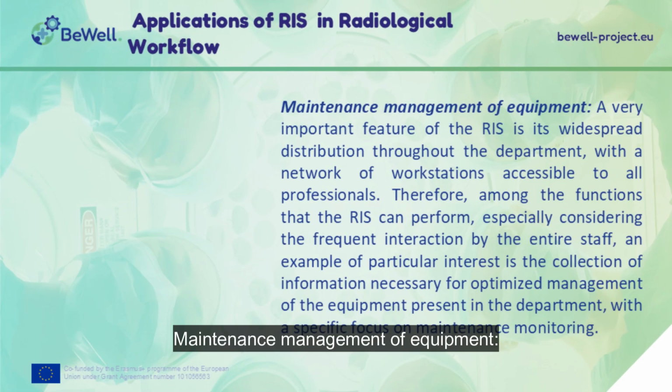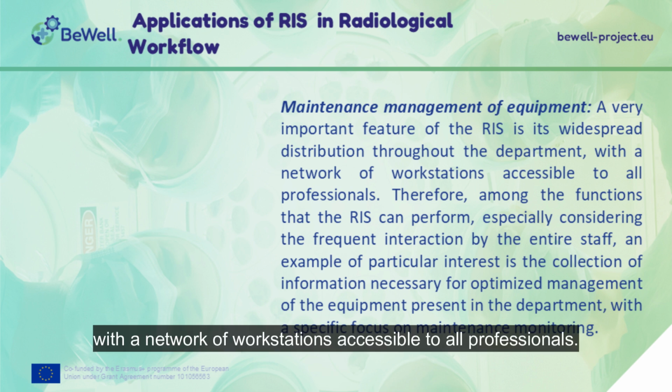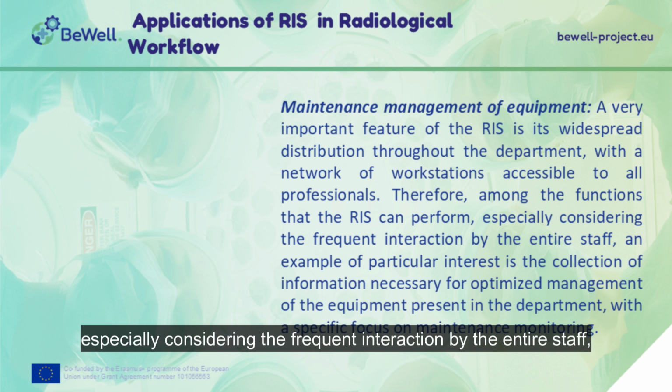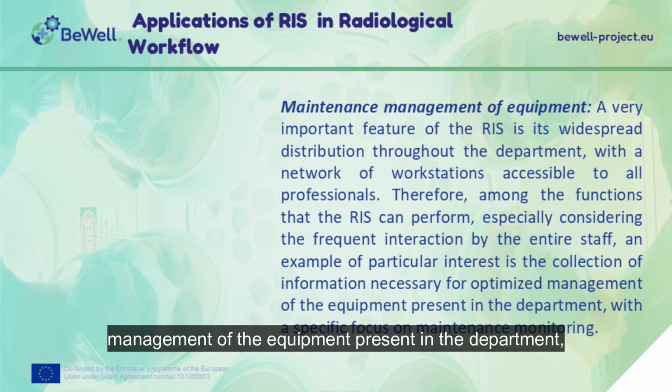Maintenance management of equipment. A very important feature of the RIS is its widespread distribution throughout the department, with a network of workstations accessible to all professionals. Therefore, among the functions that the RIS can perform, especially considering the frequent interaction by the entire staff, an example of particular interest is the collection of information necessary for optimized management of the equipment present in the department, with a specific focus on maintenance monitoring.